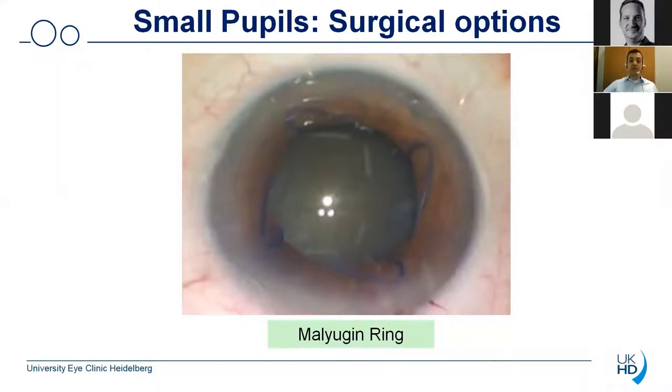Another good option that is available is certainly the Malugin ring — one of the first very good surgical devices which can nicely dilate the pupil, and you can see from that image that it also obtains quite a uniform round pupil opening. But those who have used the device also know that although this device can enter through the main incision so you don't require any additional incision, this material is quite hard. Some of you might have seen videos where this hard material can actually do harm to other ocular tissues such as the corneal endothelium, the iris, or also the lens which is still in place.